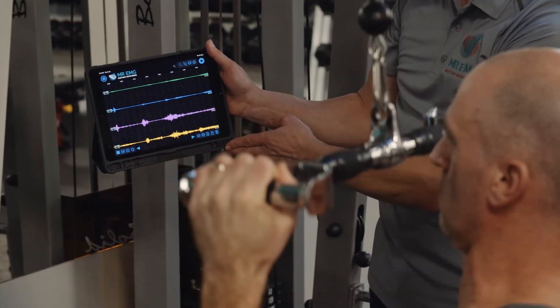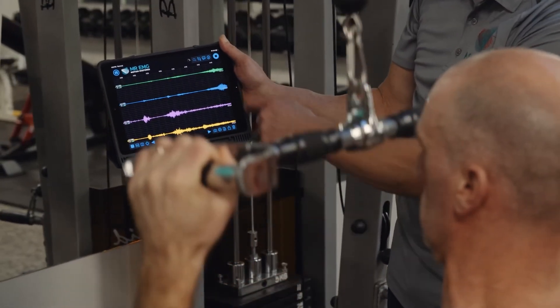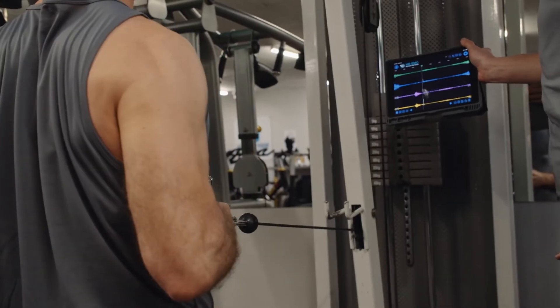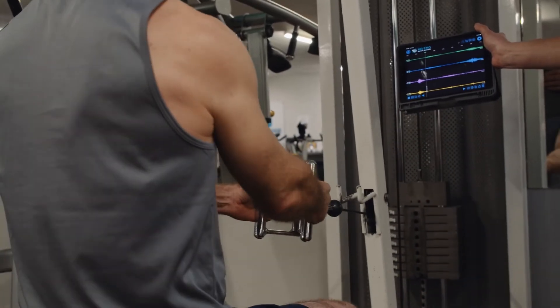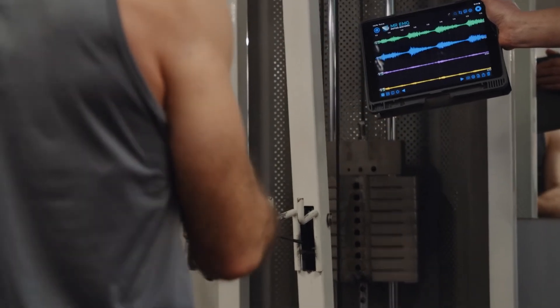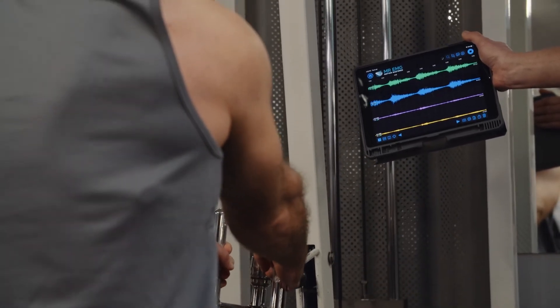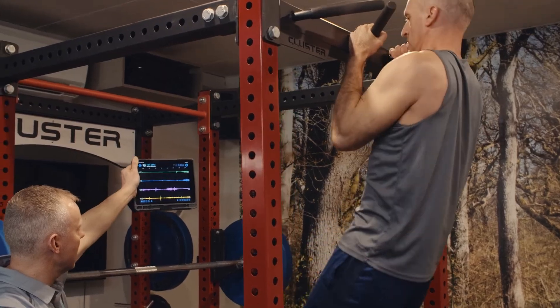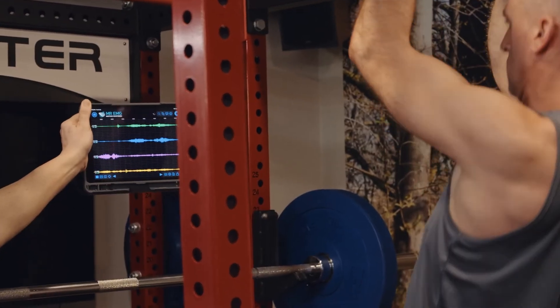We will now assess latissimus dorsi muscle activity during the lat pulldown movement and then the seated cable row, making observations of muscle activation via the MR-EMG biofeedback as we progress through the motions. The exercises you test are entirely up to you, the clinician, and what you would deem most appropriate for each subject based on their symptoms.